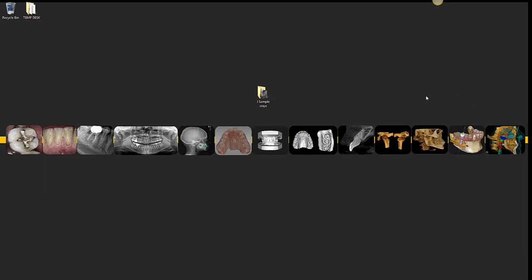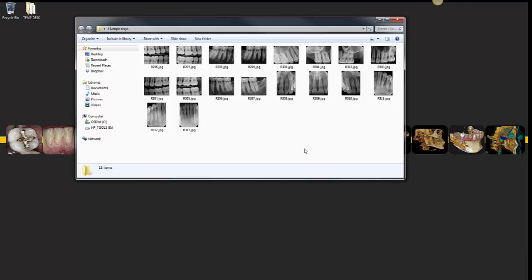First thing I suggest you do is to create a folder — just a temporary folder with the first initial and last name of the patient, just so you know exactly where the x-rays will be. Here's a full full-mouth series worth of x-rays that I simulated. These are all JPEGs, simulating downloading them from an email.